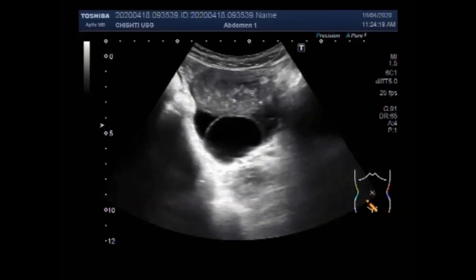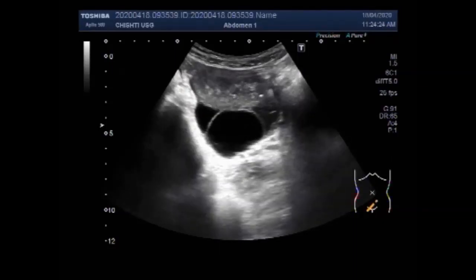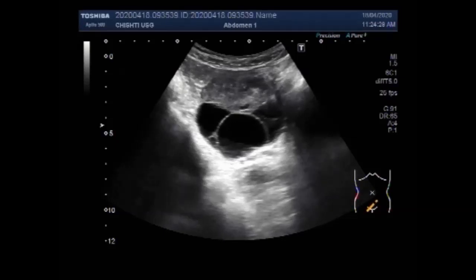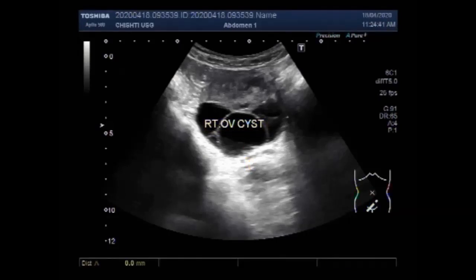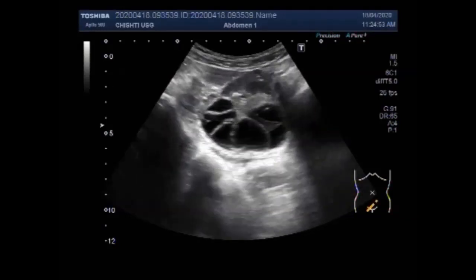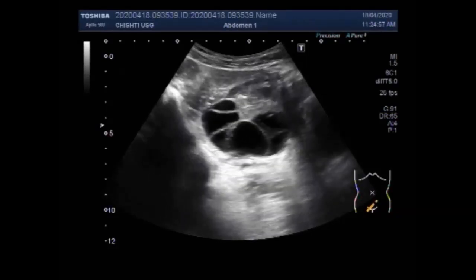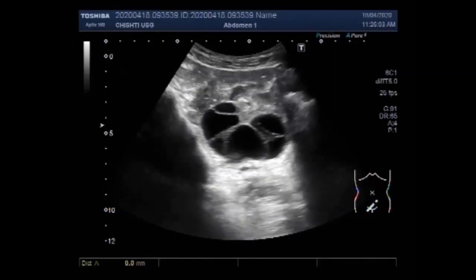Now you can see a cyst having multiple internal septations. During a menstrual cycle, the egg grows into a sac called a follicle, located inside the ovaries. Mostly this follicle breaks open and releases an egg, but if it does not break open, the fluid inside can form a cyst in the ovary. You can see the cyst having multiple septa.